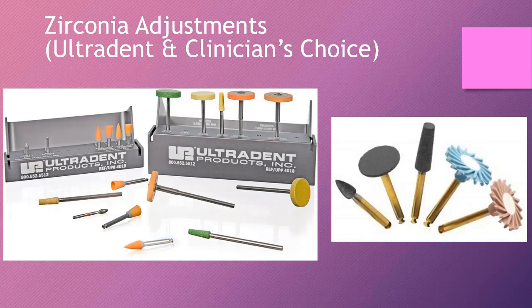If you have to adjust ceramic, people may ask, like, oh, well, what if I adjust it? The internal aspect, obviously, you're not adjusting. If you had to adjust it, you can, and then hit it with the air abrasion. But when I think of adjustment, I'm adjusting the outside. So people always ask, like, how do you adjust the outside?